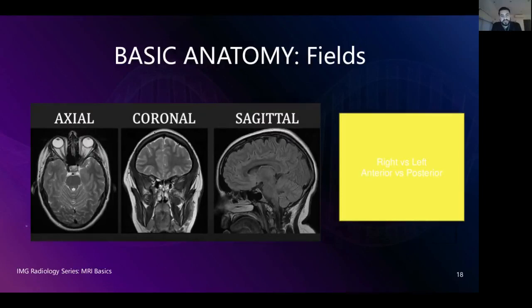Everything in radiology is very anatomical, of course, so you've got to use the right terminology when describing that particular scan or looking at whatever you're looking at, essentially. So anterior, posterior. But the most important thing here is to know what side you're looking at, basically, and what plane.